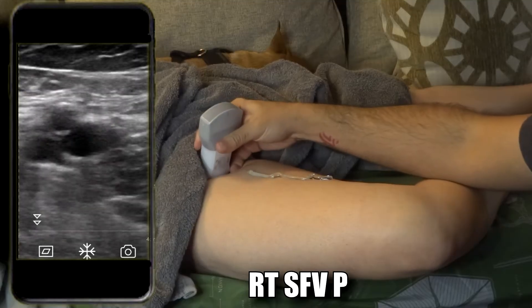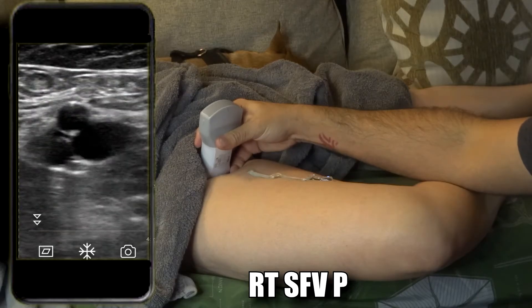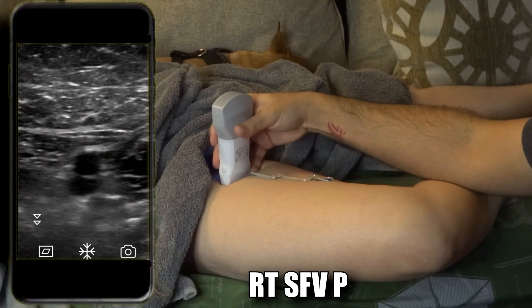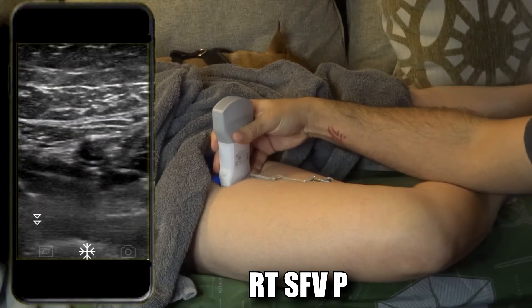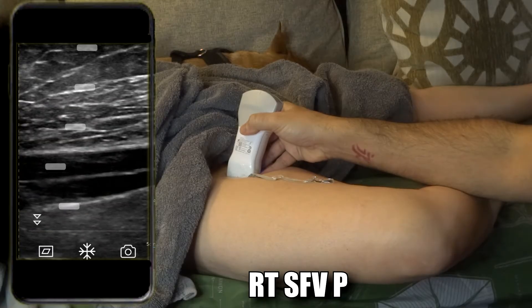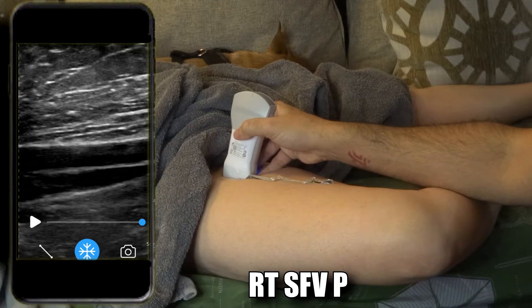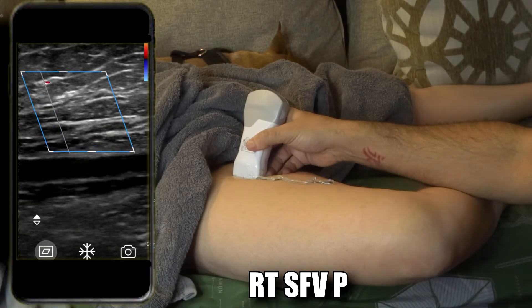From there you can continue on to the superficial femoral vein, or just the femoral vein. Mess around with the TGCs a little bit to clear up the image. Go down a little bit, increase the depth, more TGCs — it clears right up, very clear. Freeze, take the picture, compress, freeze, take the picture, and then sagittal. Always use TGCs and gain to enhance your image — that's a decent image right there. Freeze, take the picture, unfreeze.